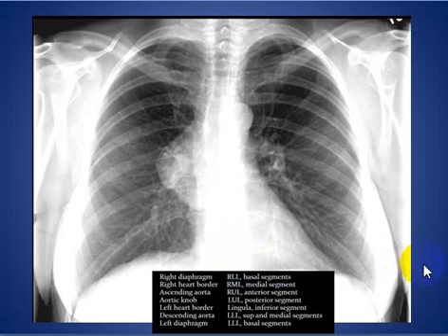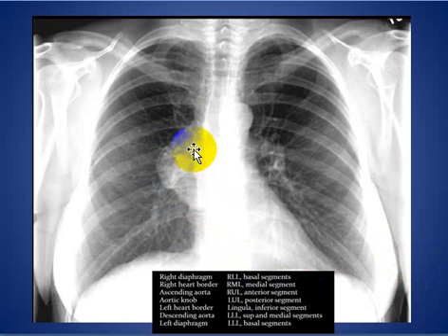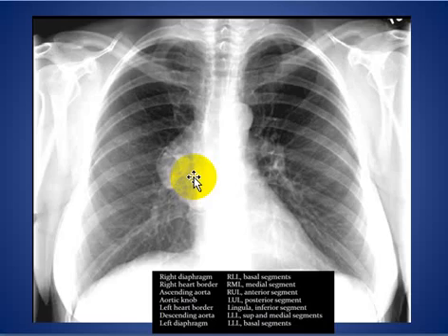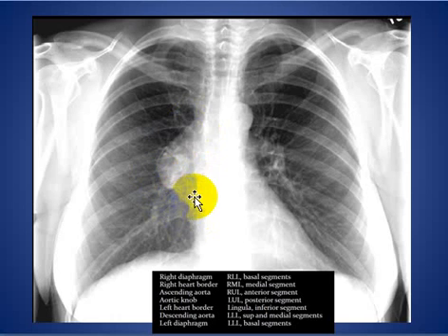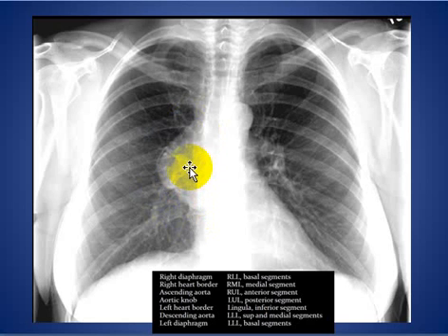We can also apply the silhouette sign to masses. Here there is a soft tissue mass on the right side obliterating the region of the ascending aorta, so this mass is located anteriorly in the anterior mediastinum. As we know, the differential diagnosis of masses in the anterior mediastinum includes teratoma, thymoma, retrosternal goiter, and lymphoma.